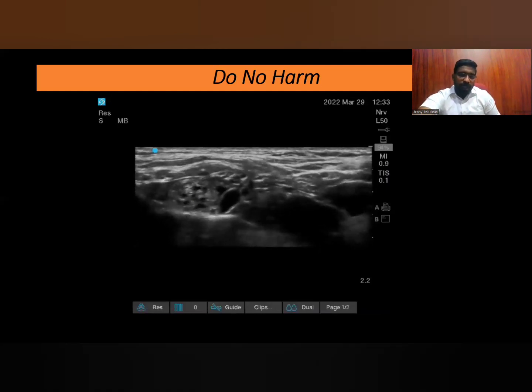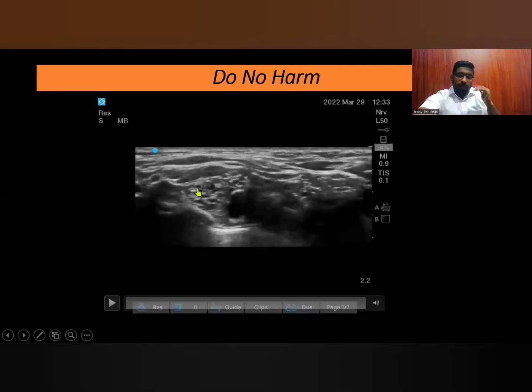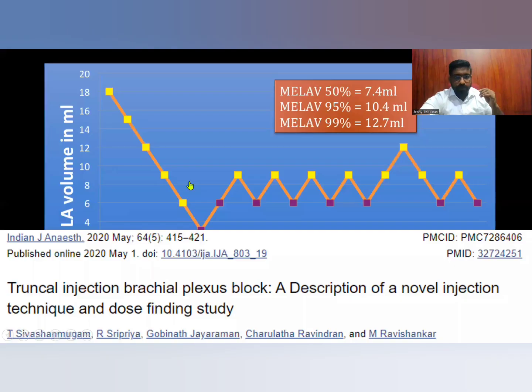It should not be done even with high definition ultrasound. What you have to identify, and it takes years of experience, is the paraneurium of these trunks, and deliver the drug in the right place. This is not the way to do it. This is not how I want people to do it. We need to dissect out the space and give the drug, say 3 or 4 ml for each trunk.